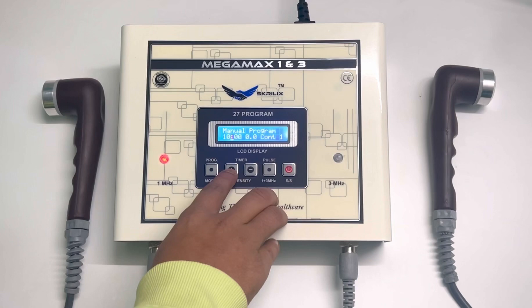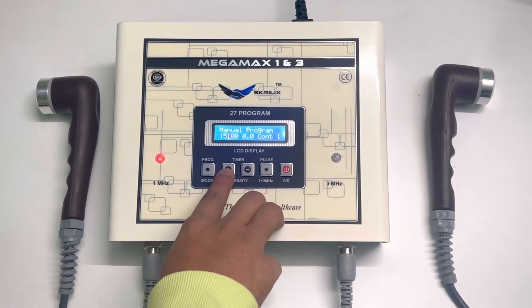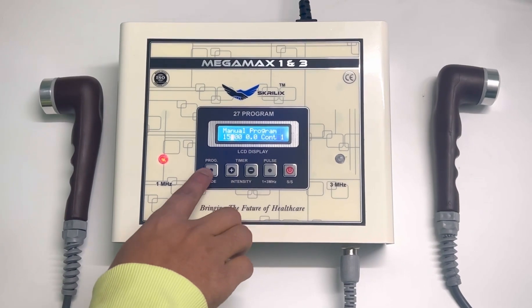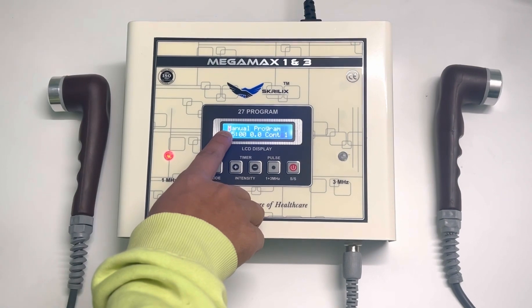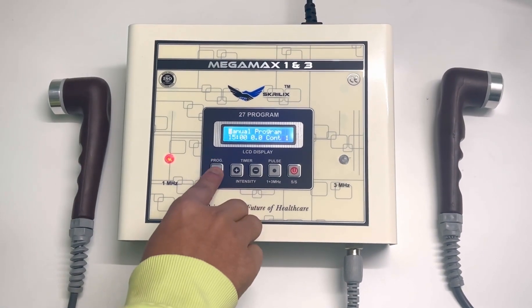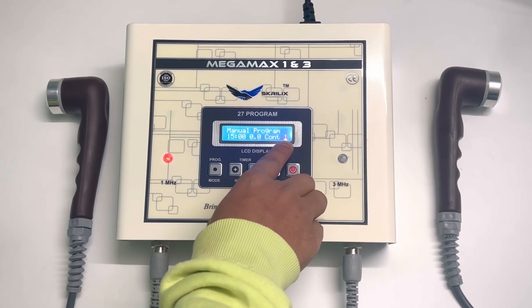You can increase the timer like this, and then you have to press the program mode button. As you can see, it will now be in manual program mode.